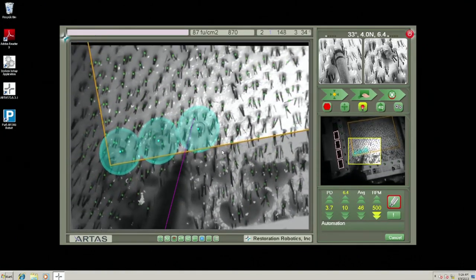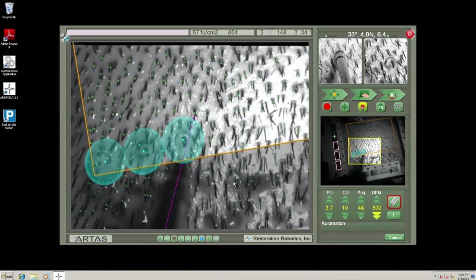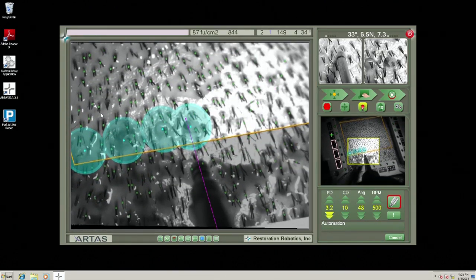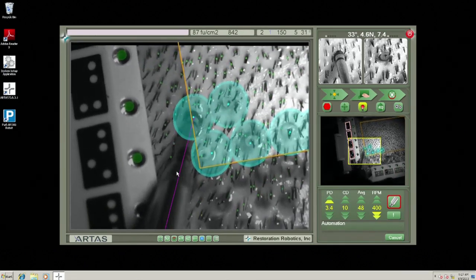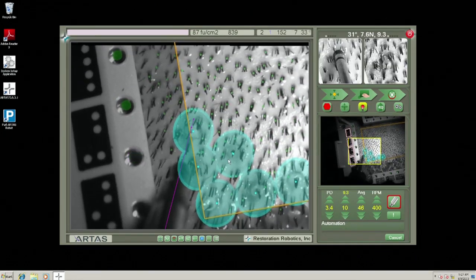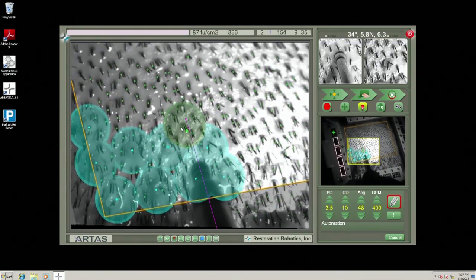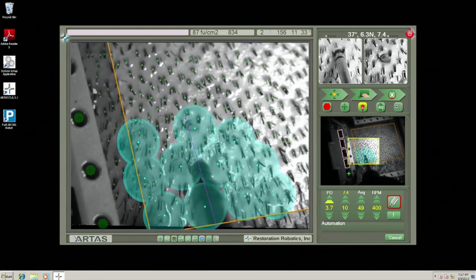Yeah, that's a very astute point to think about. You can do one of a couple things. If you know that you're going to come back, if you have somebody who's particularly follicularly challenged, or you have a high thought that someone is going to be back for an additional procedure, you can either avoid going through those areas, or you can decrease your parameters through those areas the first time, knowing that you're going to go back through that area. So there's a couple ways to approach it. It just depends on how many grafts you need and how big your cases are, and if you're going to go back in that area, my thoughts are to be a little bit more conservative and spread out your donor area a little further out.